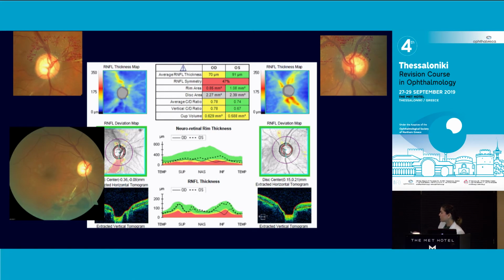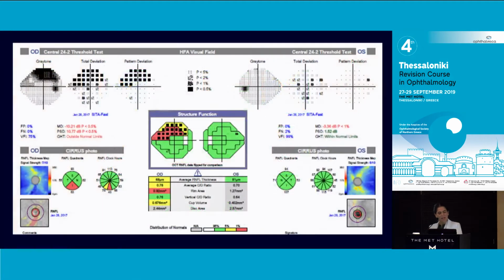And that's one of the things we always need to remember, because we need to check the rest of the retina. Okay. And this is the defect, which of course is consistent with the BRVO, but it could be glaucoma as well. So just by looking at the defect on the OCT, you'd say that that's glaucoma. Fine, okay, so we all agree on that. And the left eye seems to be all right.